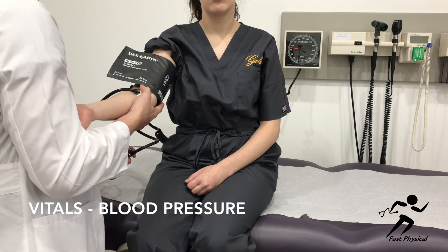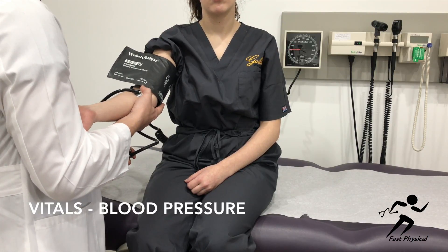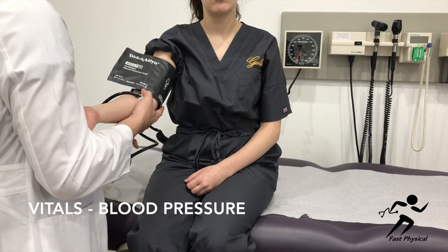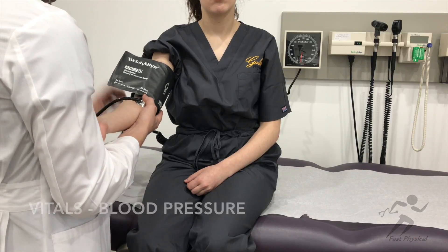The first Korotkoff sound will be your systolic pressure. When the Korotkoff sounds disappear, this is your diastolic pressure.